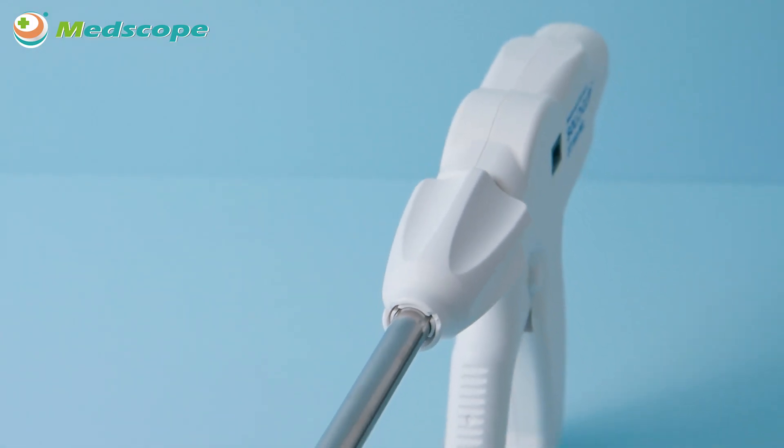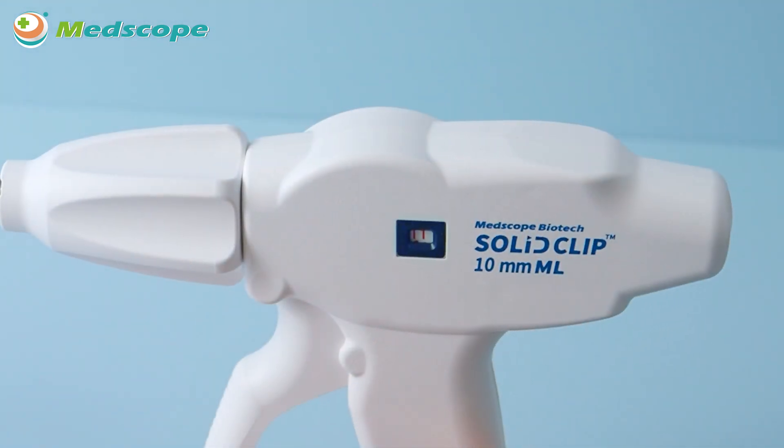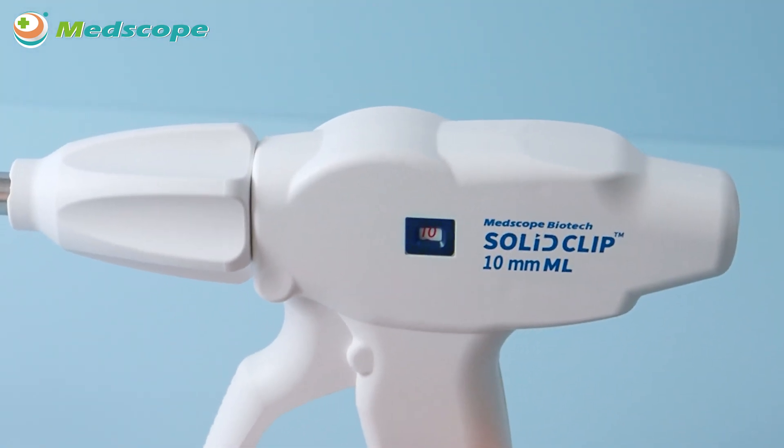Advantage 4: User-friendly design of the counter window. Our counter window by the side supports surgeons to be aware of the remaining clips easily during the operation.